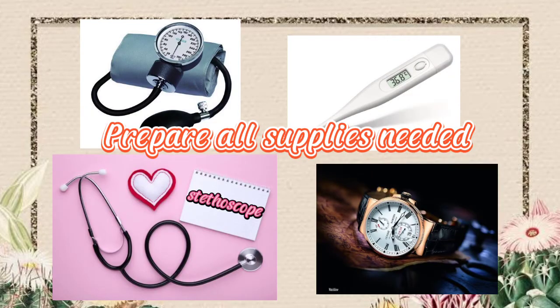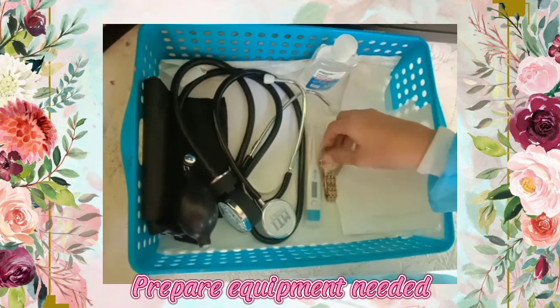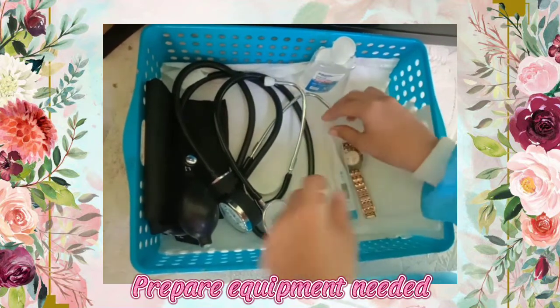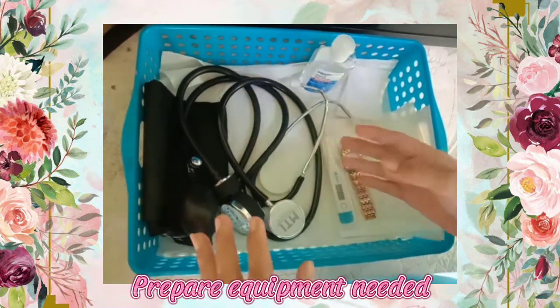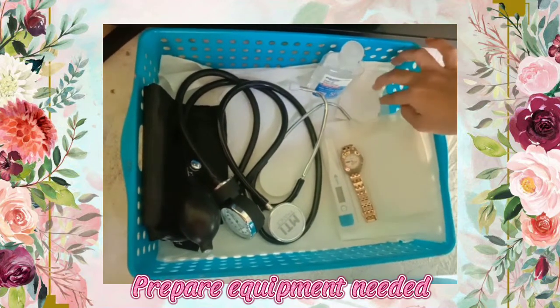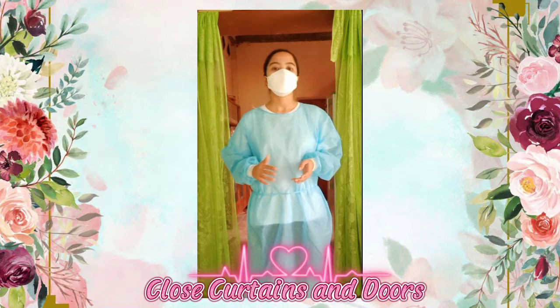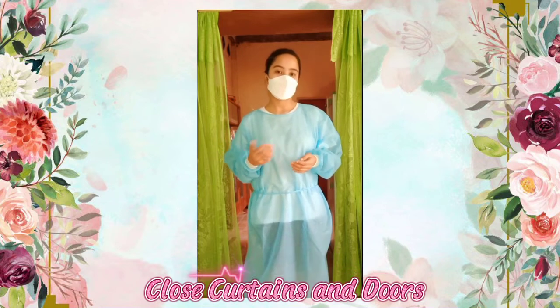Prepare all supplies needed. The paraphernalia needed in assessing the vital signs includes watch, thermometer, stethoscope, sphygmomanometer, and we also need to have our alcohol and our wipe cloth. In any procedure, it is important to give our clients privacy and comfort, so we need to close the curtains and also the door if possible.